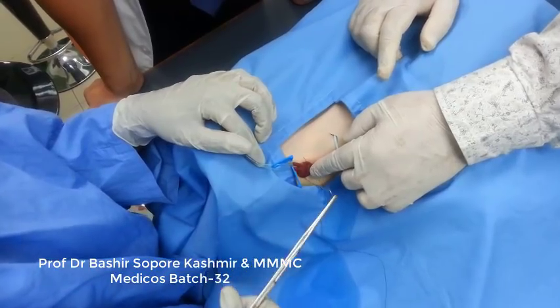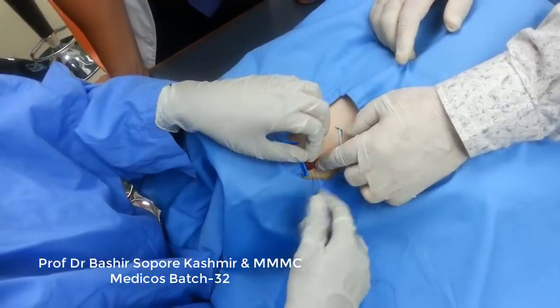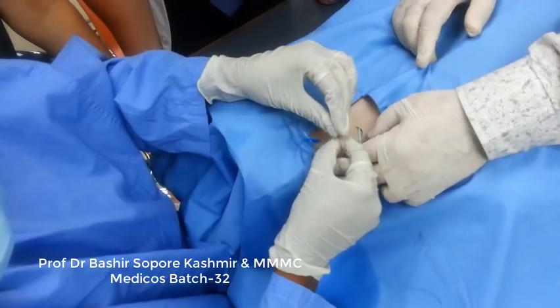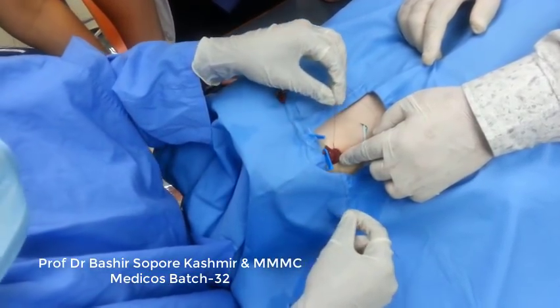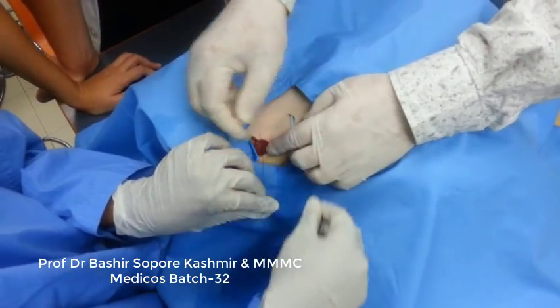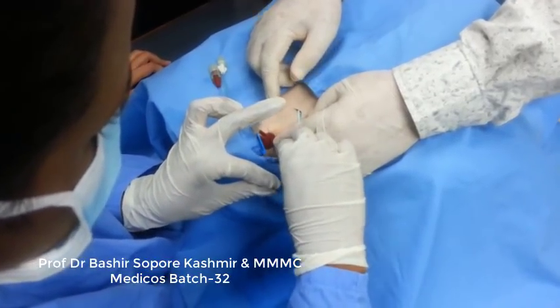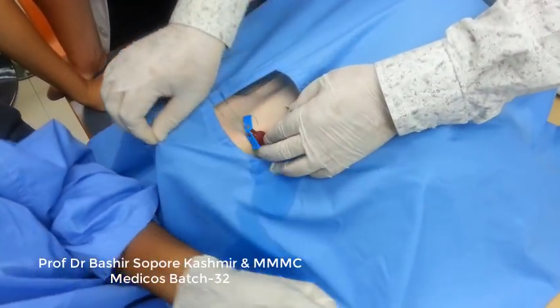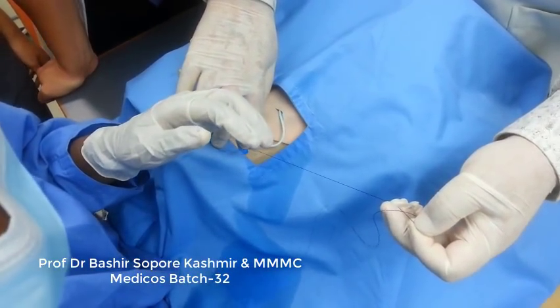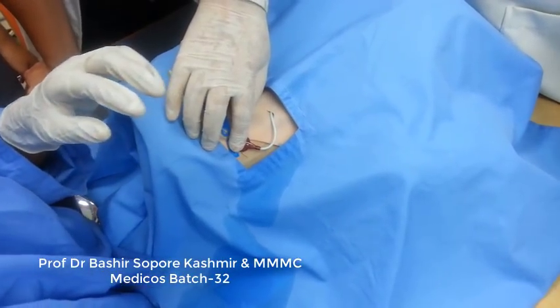Okay. So after the suture, we just tie it. After that, you can cut it. There's no scalpel here. So cut it. Then we will put the dressings. You understand my point? So get the dressing. You cut it here. Cut this one also. Complete procedure we have shown, isn't it?